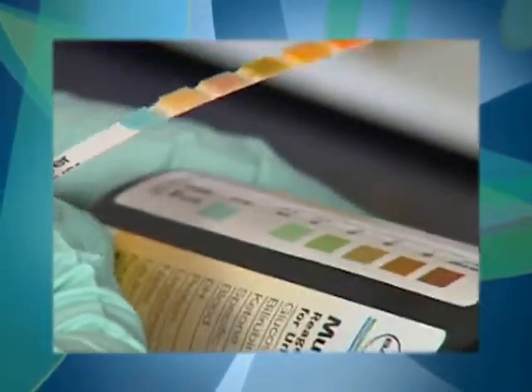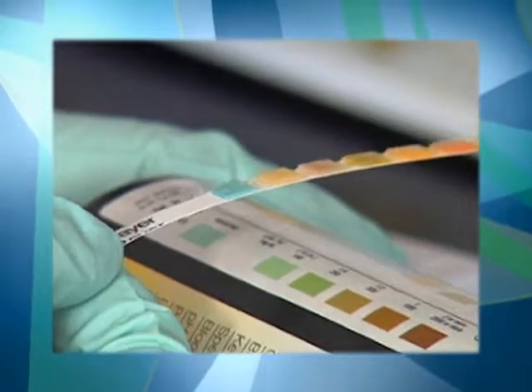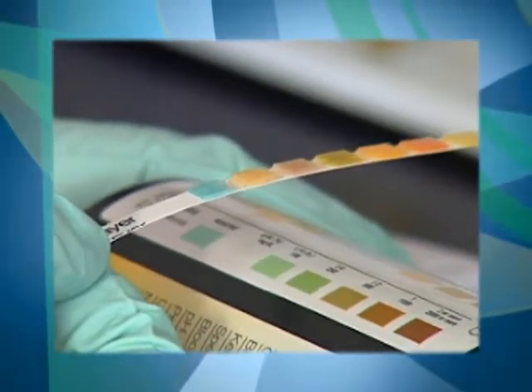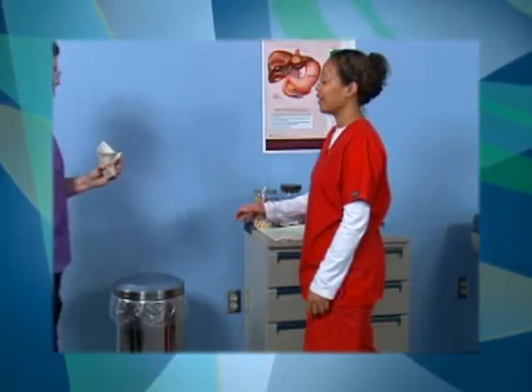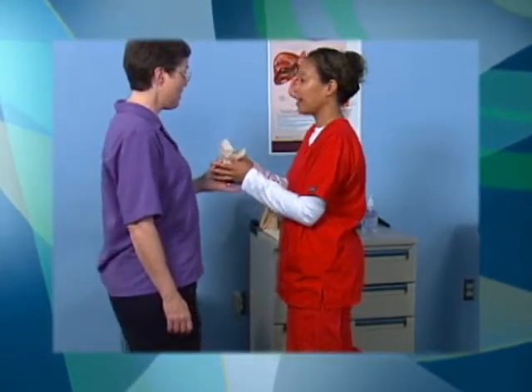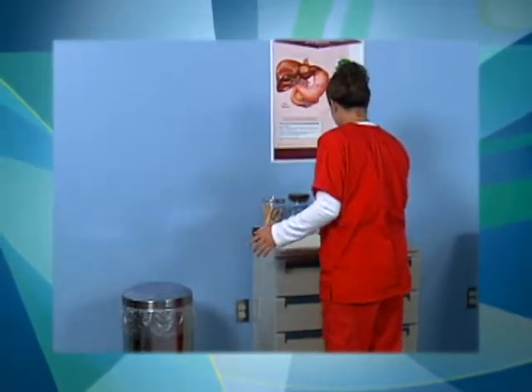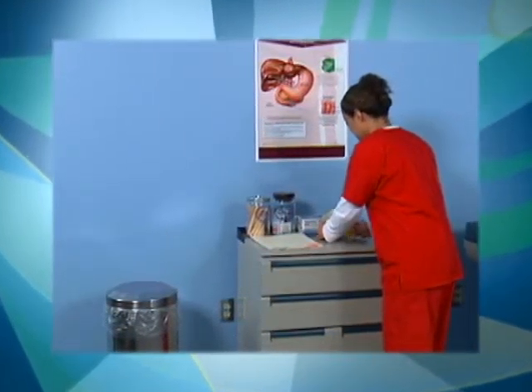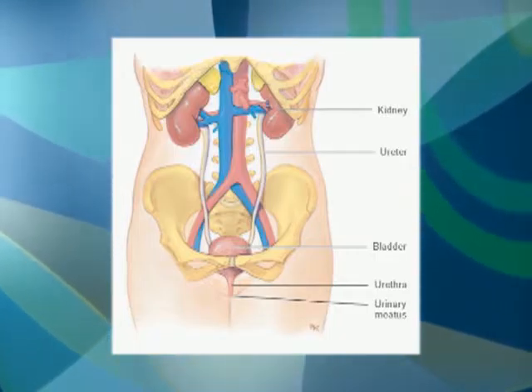Urine testing is frequently performed in the medical office. The advantage of urine testing is that urine is readily available and does not require an invasive procedure. The type of test to be performed often dictates the method used to collect the urine specimen. A clean catch midstream specimen is recommended for identification of the presence of a urinary tract infection.